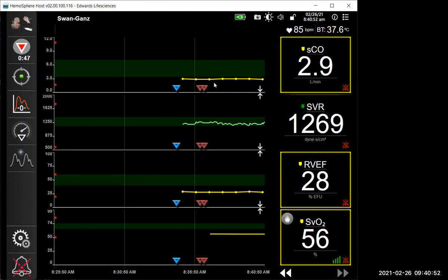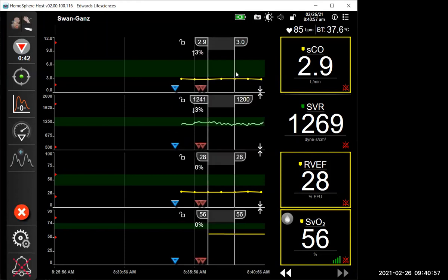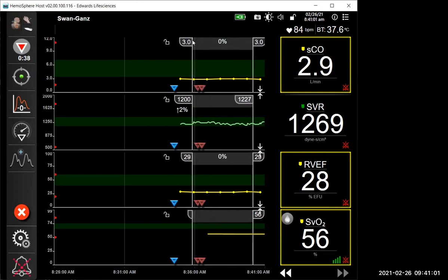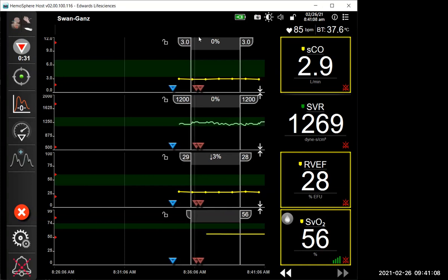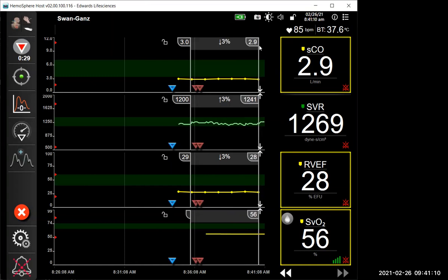So now that I have these markers up here, you actually have to hit the screen with 2 fingers to do this, but once you do, you can look at your percent change and move these little cursors, which is nice. So if you're ever dropping your interventions, that little triangle, it's kind of nice to see the change over time in your patient.